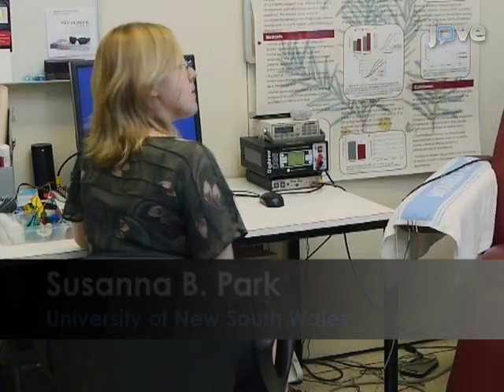Demonstrating this technique will be Dr. Cindy Lin, a Senior Lecturer in Neurosciences, and Dr. Susanna Park, a Post-Doc from the laboratory.